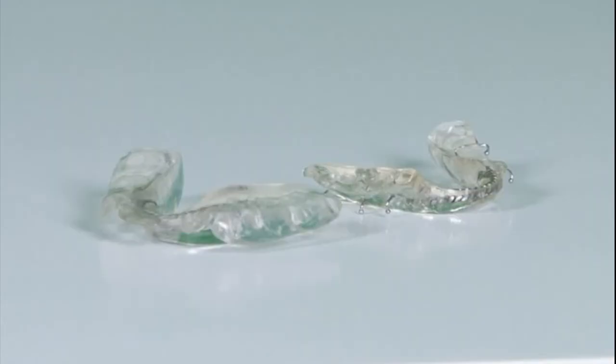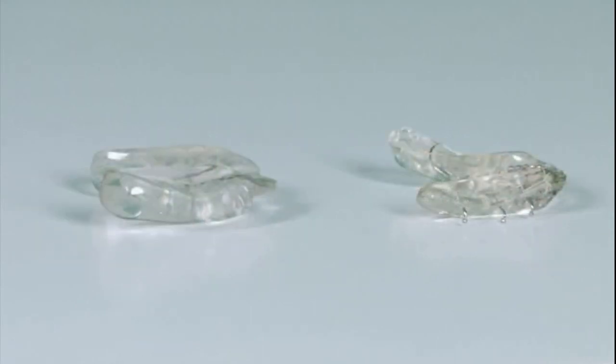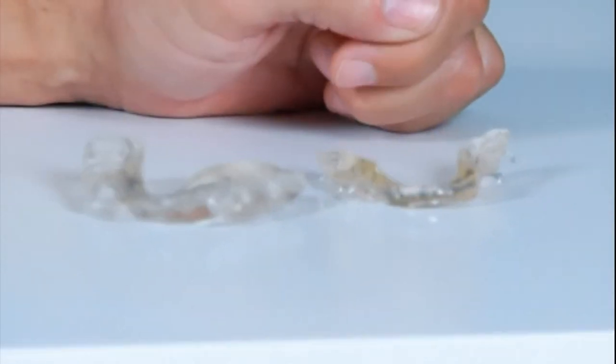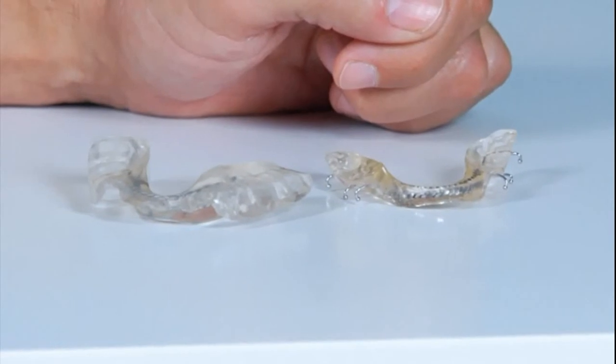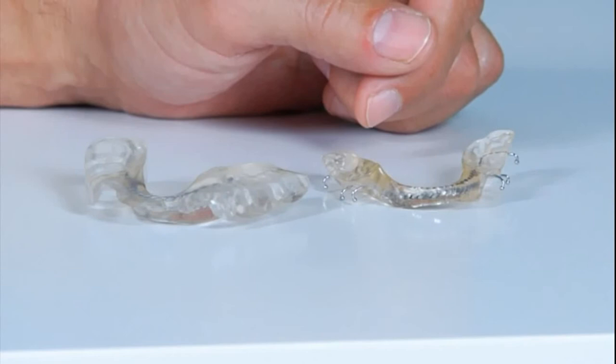The majority of the treatments that we perform include specially designed mouthpieces called neuromuscular orthotics. These are fancy mouthpieces that are custom fitted for every individual patient based on the previous test results and examination findings. The goal of these appliances is to decompress the pressure from the jaw joint by relaxing the muscles and making them stop contracting. This orthotic must be worn 24/7 for at least 4 months in 90% of the chronic patients that we see.